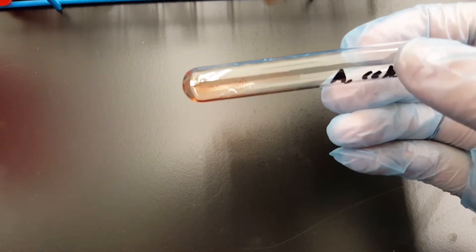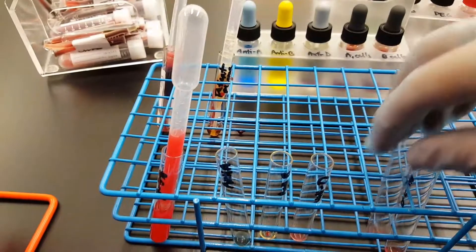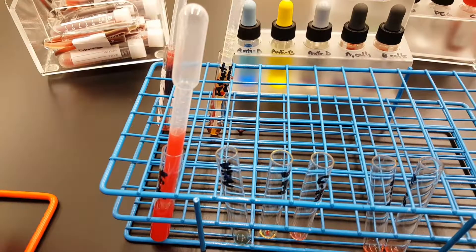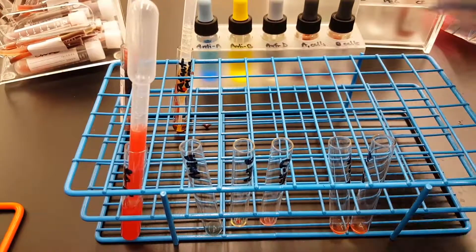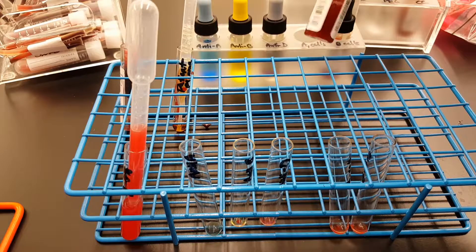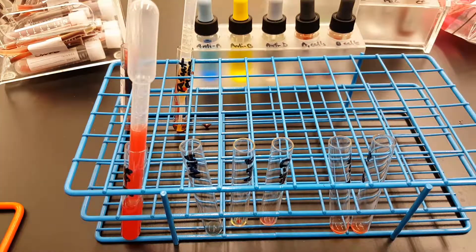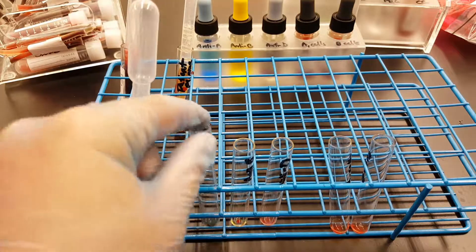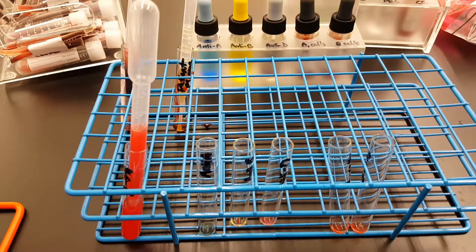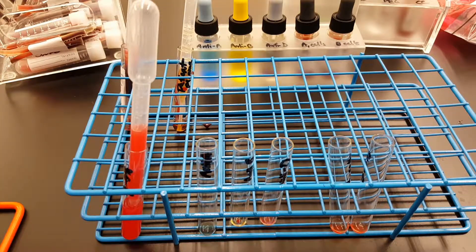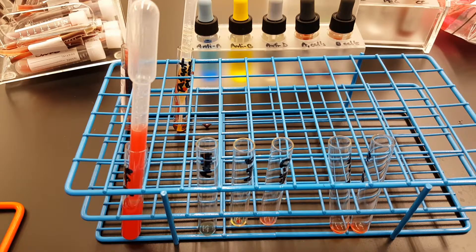And again we know that the reverse cells, they're already expired, so that's why we're not getting such a strong reaction to match the strong reaction that we had in the forward. Thank you very much, and that was ABO typing.